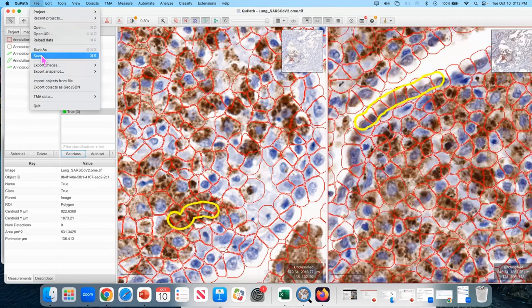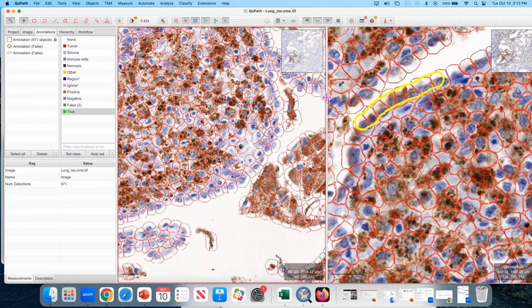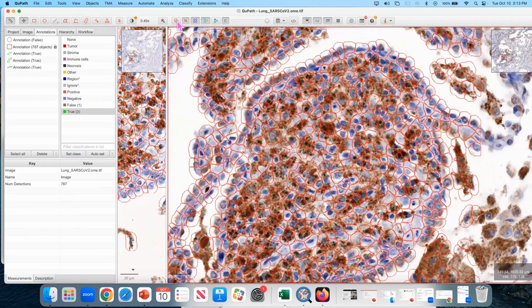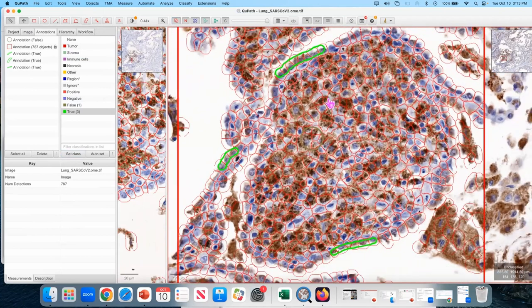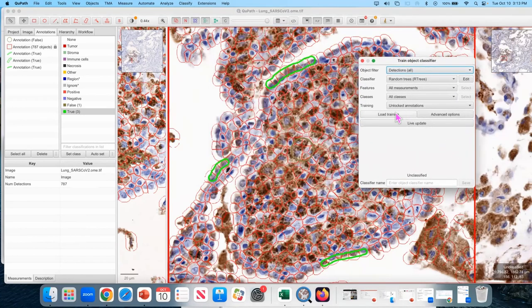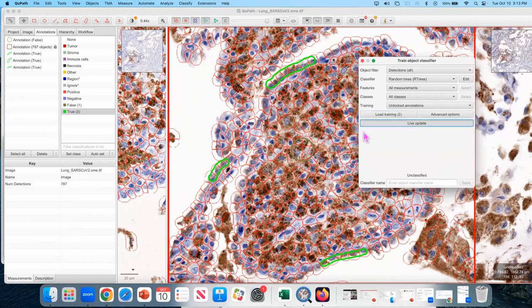I will make sure that I save the data. I'm gonna go to this image and I'm gonna make sure they save the data. So I'm gonna focus my attention on this image right now. And what I will do is I'm going to go to classify, object classification, train object classifier. And we will do what we learned previously. We're gonna load train. I have two available images I'm gonna add. There is a warning that this specific image is open. That's fine. And I'm gonna hit live update.